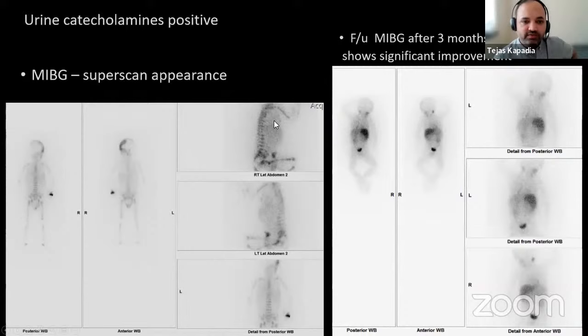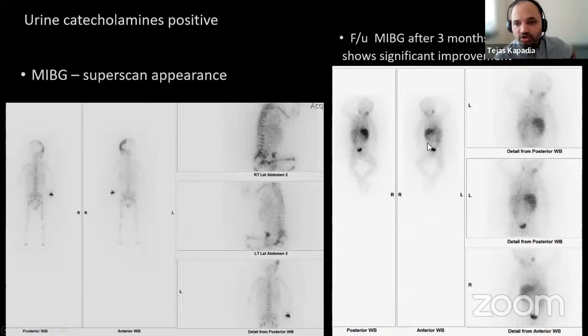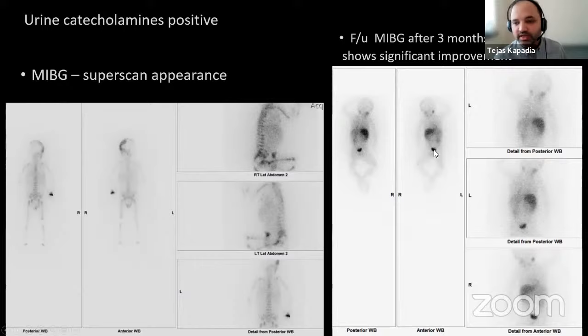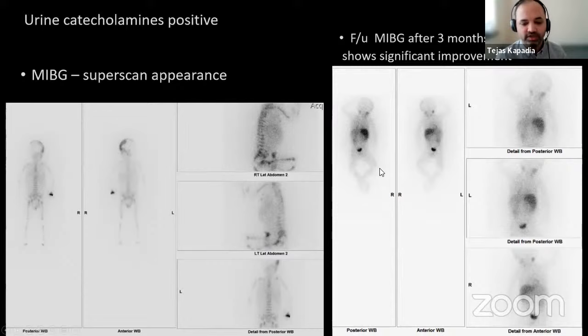Post-treatment MIBG scan shows now normal uptake in the liver, salivary glands, urinary bladder excretion, and renal areas — significant improvement compared to the previous scan with hardly any bony uptake. This was indeed a neuroblastoma presenting with purely bony involvement and no lesion found anywhere else.